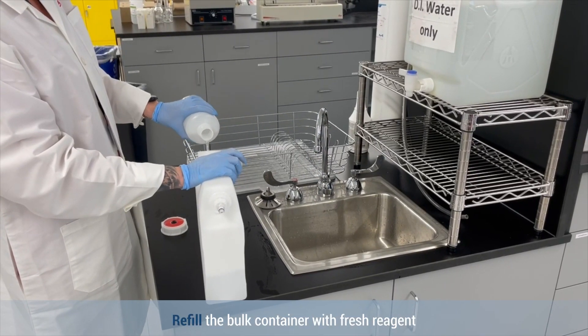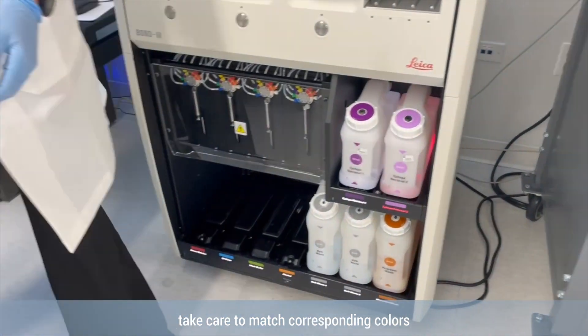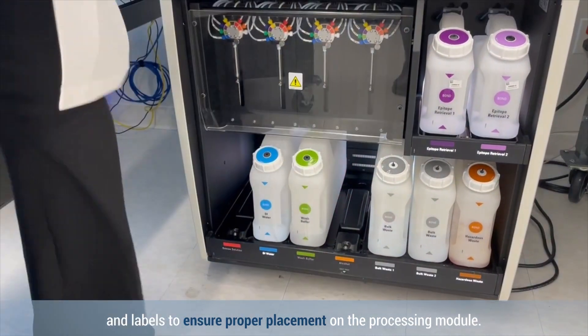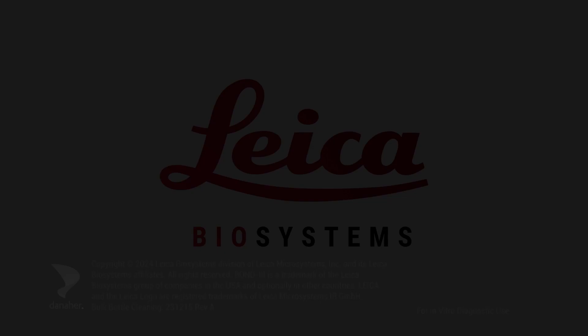Refill the bulk container with fresh reagent and return to the instrument. While replacing the bulk containers, take care to match corresponding colors and labels to ensure proper placement on the processing module.